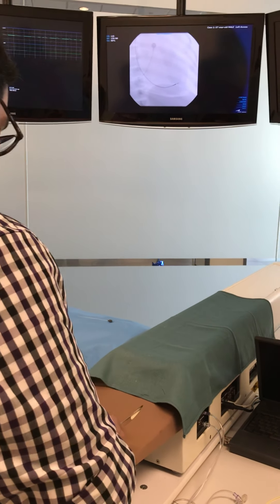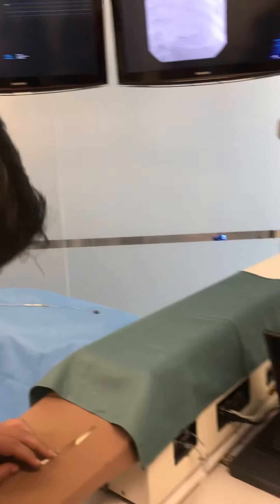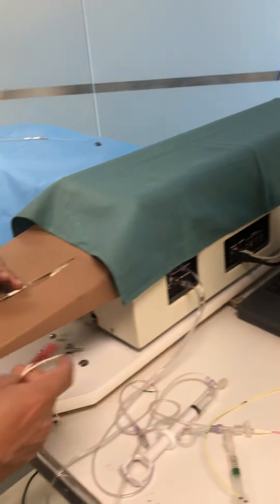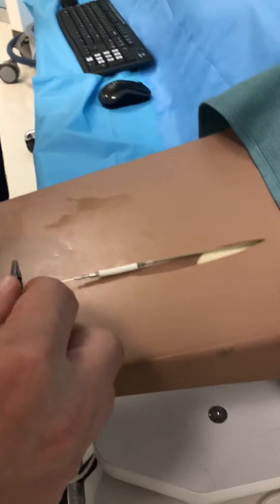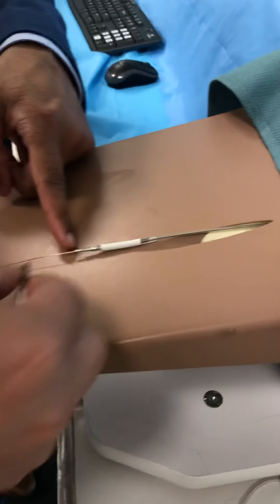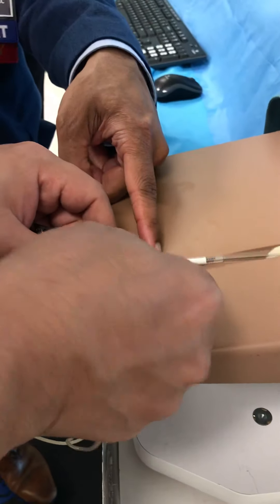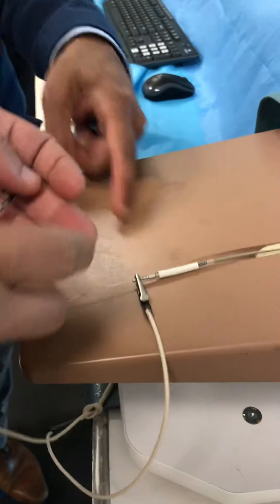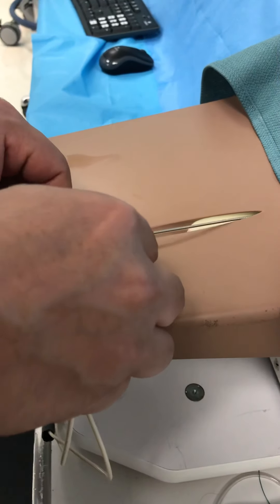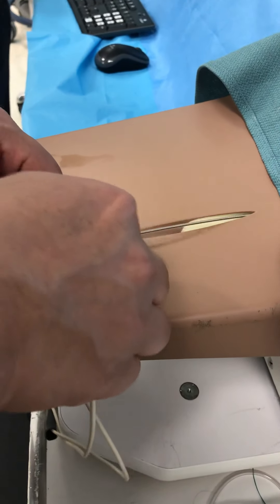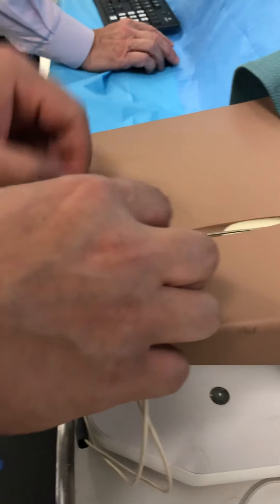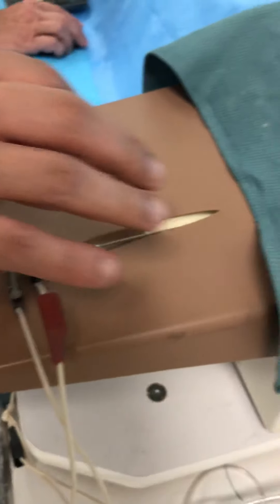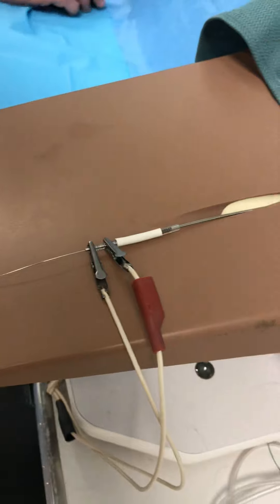We need to hook up our alligator cables, which are right over here. Black on the tip. Black on the tip, which is this. And red on the ring. Red on the ring that I was looking for, this red ring.